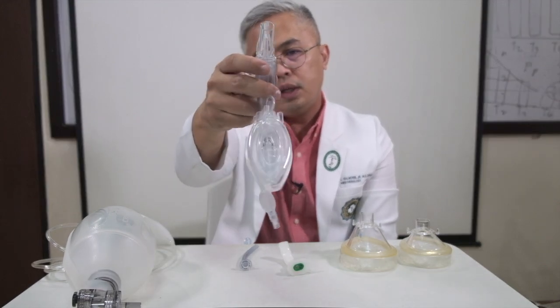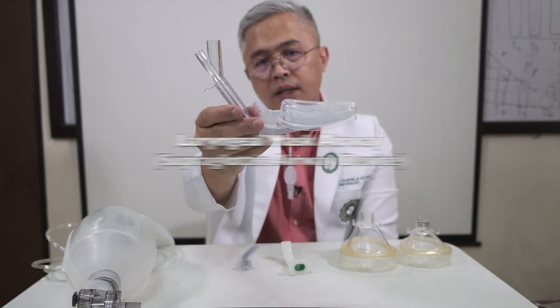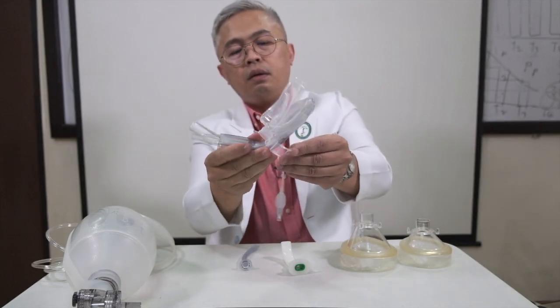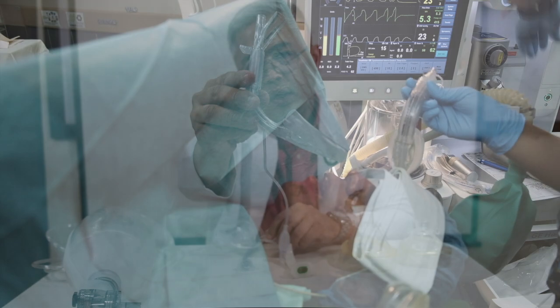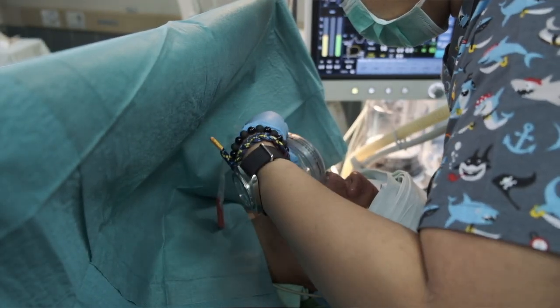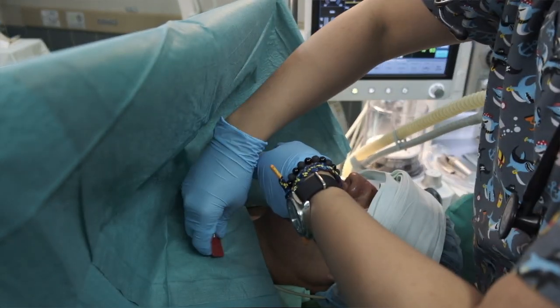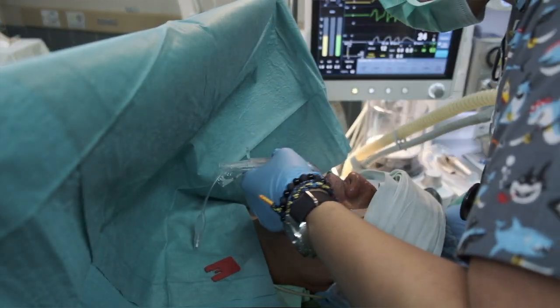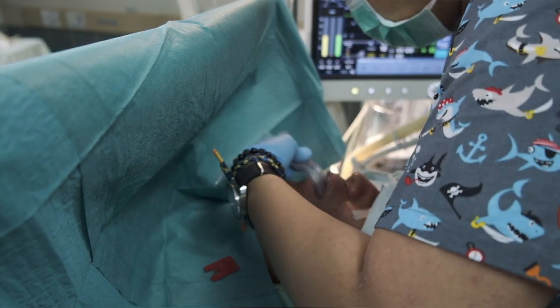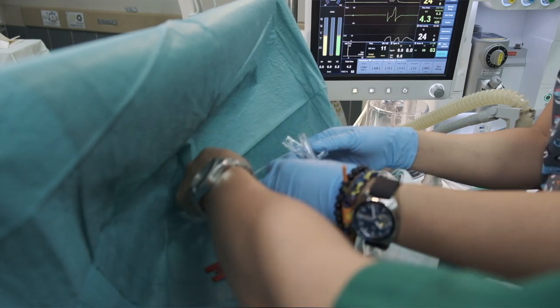This one is what we call a supraglottic airway, specifically a laryngeal mask airway. We use this for general anesthesia as well, and to alleviate obstruction during induction and anesthesia. This is very effective, single use, and comes in different sizes as well. This is a size 4 laryngeal mask airway.